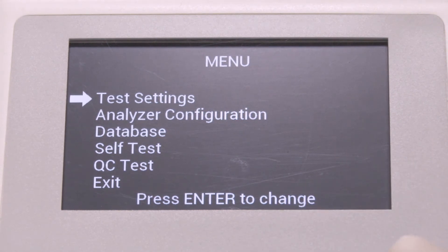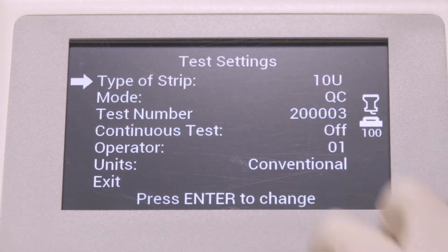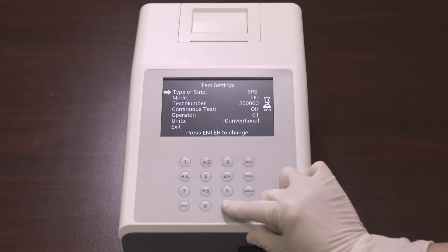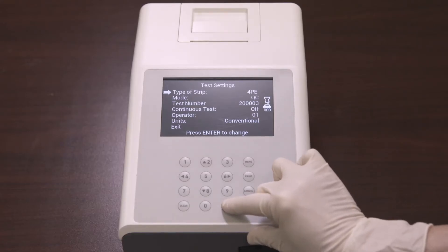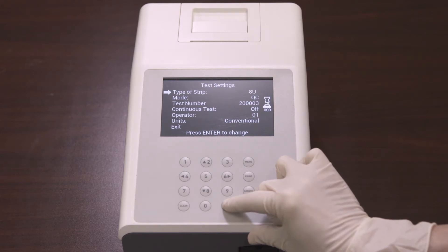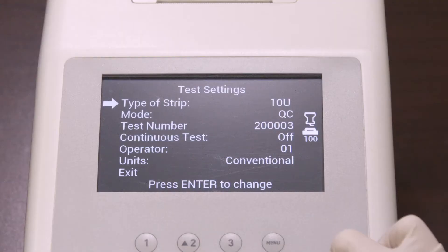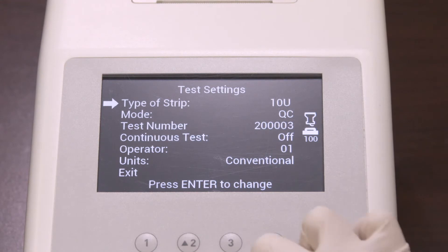To input the type of strip, press enter to change the strip type. Each strip type name defines the number of test parameters, and each press of the enter key cycles through all options. Keep pressing enter until the type of strip matches the strips to be used. In this case, we'll use 10 parameters. After selecting the type of strip, select the mode and press enter to change the mode.